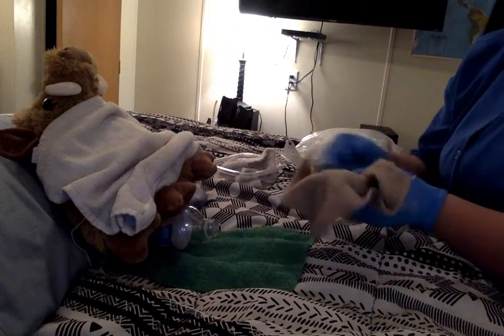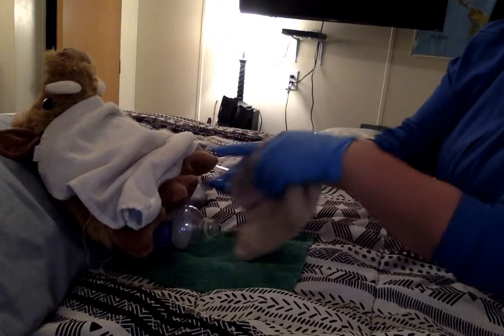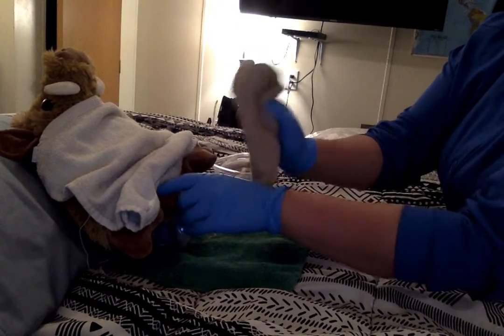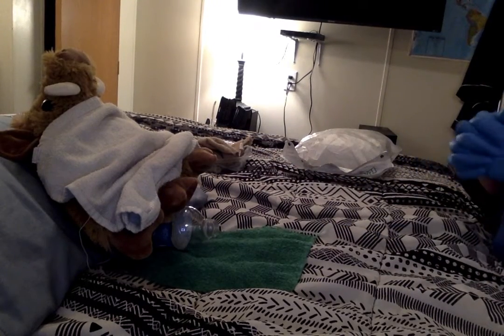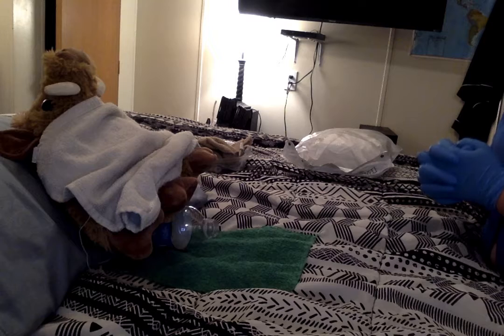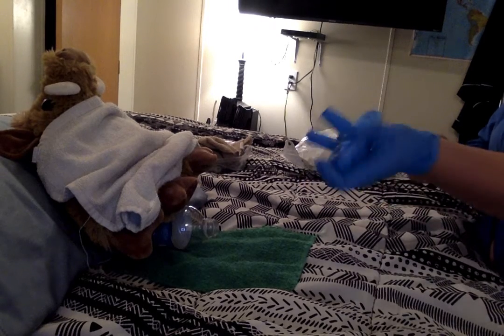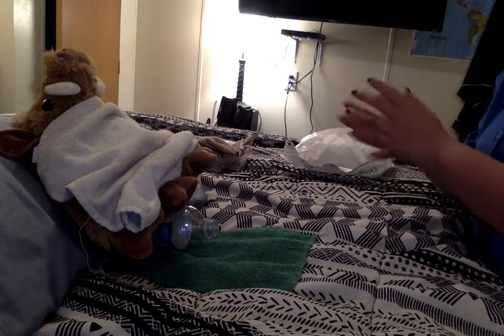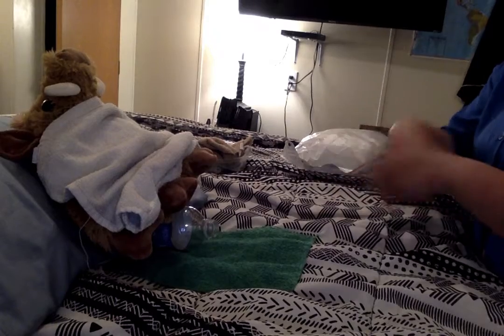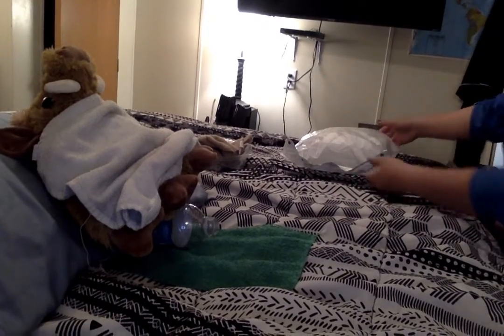Now we're going to pat the patient dry. We're always going to make sure that we're wiping from front to back so as not to give our patient a urinary tract infection. So now we're going to remove our gloves and throw them in the trash. We're going to perform our hand hygiene, and we're going to start opening our kit.